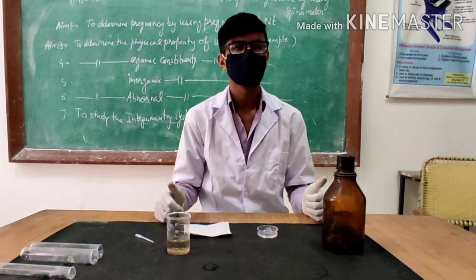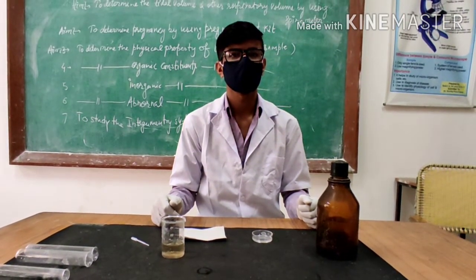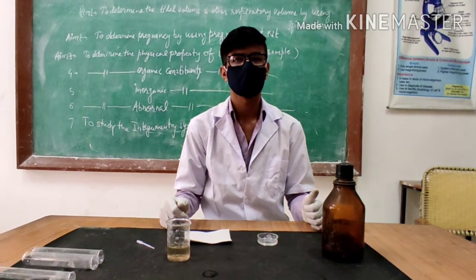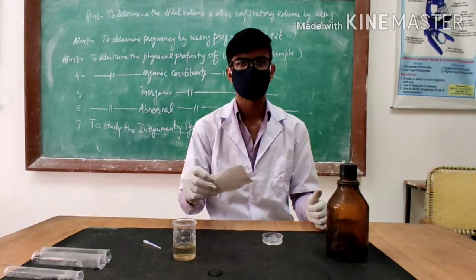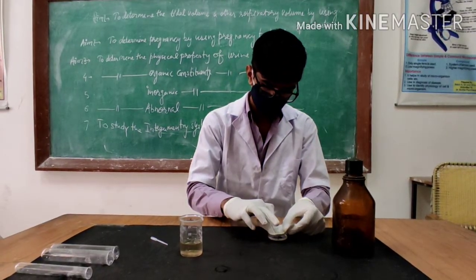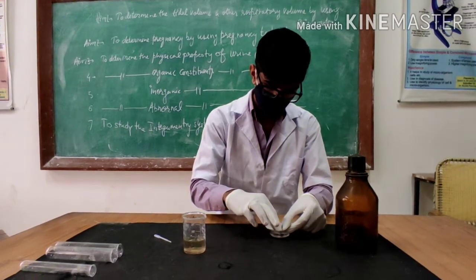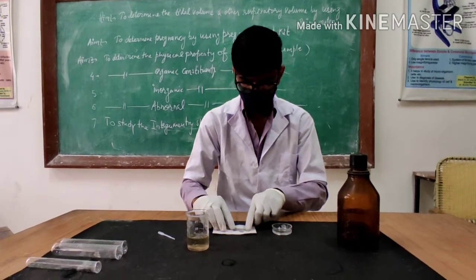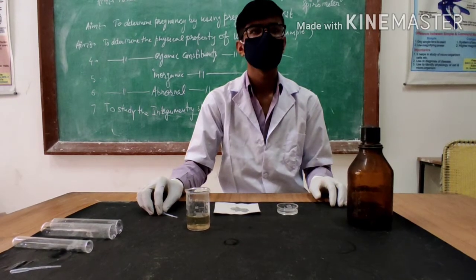The following test is known as Schiff's test and is used for the determination of uric acid in the given urine sample. Firstly, we will moisten a strip of filter paper with AgNO3 solution. After it is completely moistened, we will add a drop of urine.